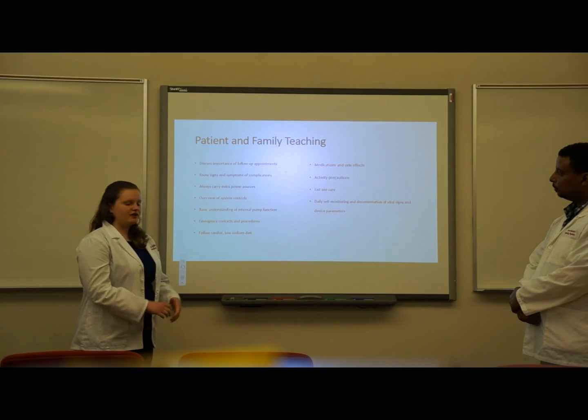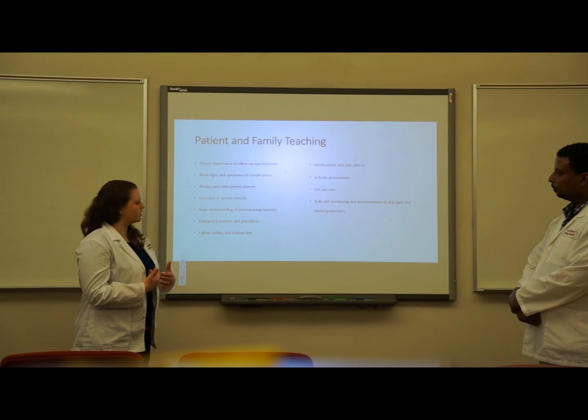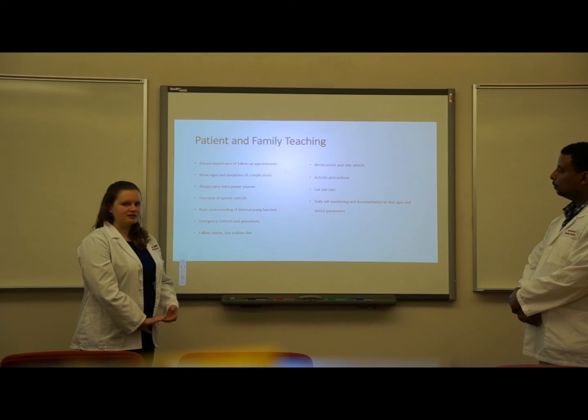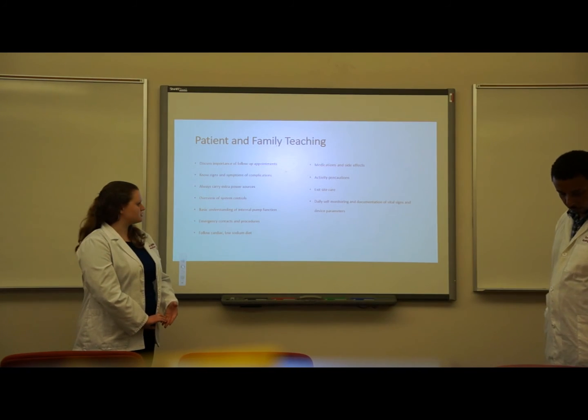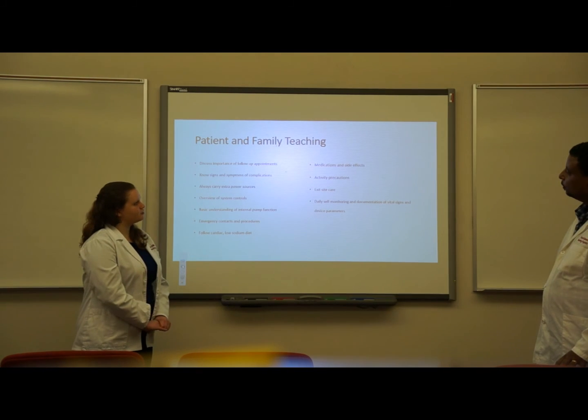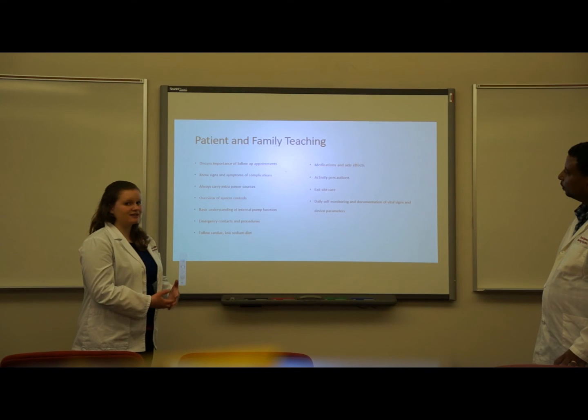They should have a general overview of how the system works and a general overview of how the pump internally is physically working on their body. They should know their emergency contacts and understand emergency procedures. They should follow a cardiac low sodium diet. You should teach them their medications and the side effects of their medications and the purpose of their medications.